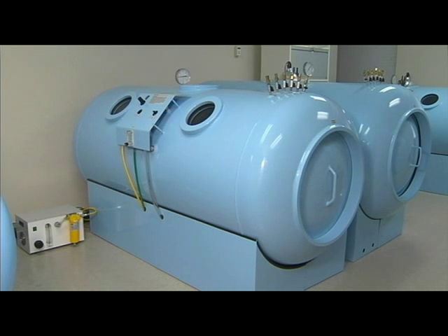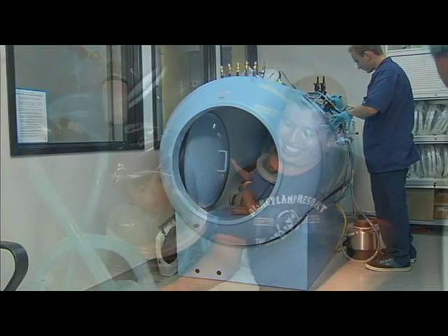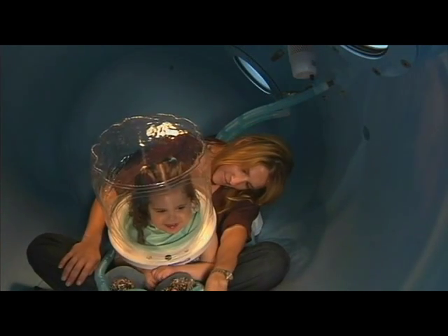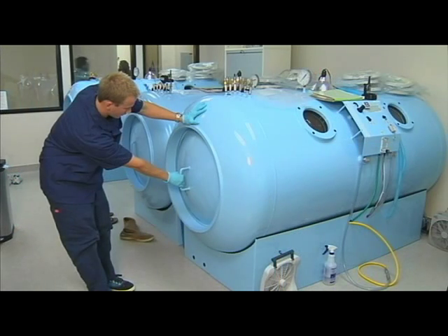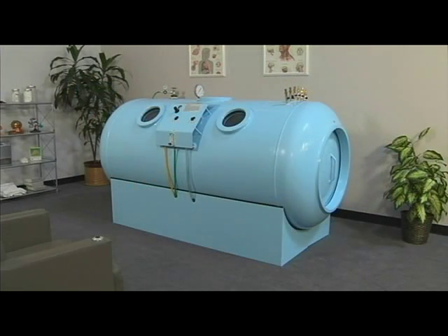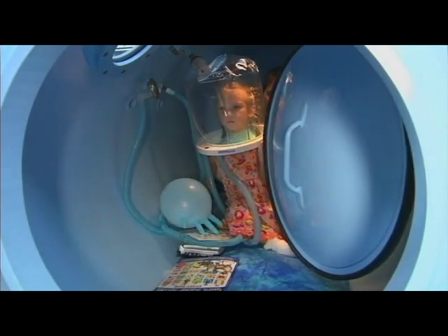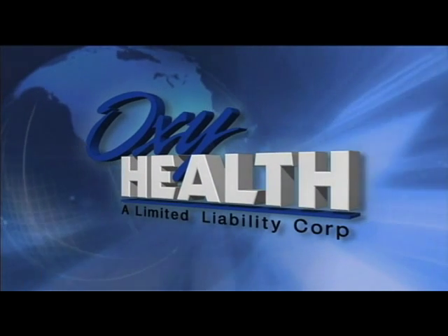The 40s 420 is engineered and built to provide decades of trouble-free service. It offers a simple, safe, and durable design which provides higher pressure levels than portable chambers. Whether used in a small private practice or a large clinic setting, the 40s 420 maintains the OxyHealth tradition of providing affordable hyperbaric chambers which significantly benefit both the patient and the physician. OxyHealth — bringing hyperbarics to you.